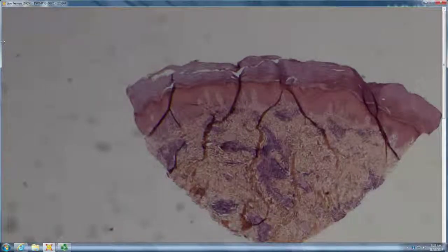Okay. I think epidermal is no change. Oh, lack of epidermal change. Often you have epidermal change as a clue in bug bite. That is true. This one didn't have it, so I can see how that made you question it. You don't always see the epidermal change. That's often plane of section. But that's a very good observation, that the epidermal change is one of the things that distinguishes bug bite from other DHRs, because they usually don't have an overlying epidermal spongiosis. Whereas with bug bite, if you actually get the site of the bite itself, that helpful clue is the overlying epidermal change.